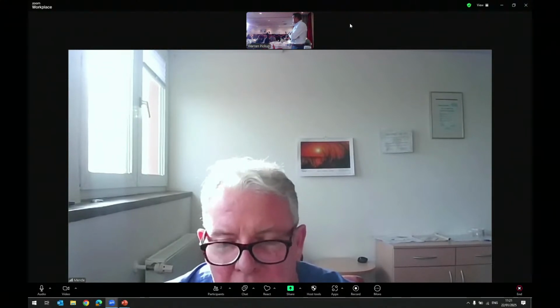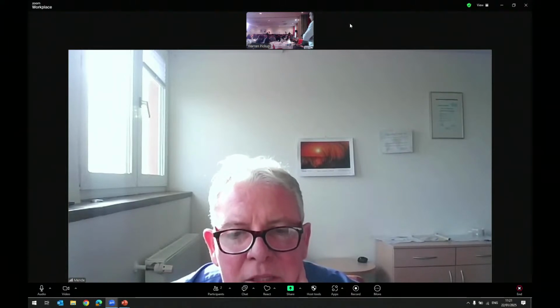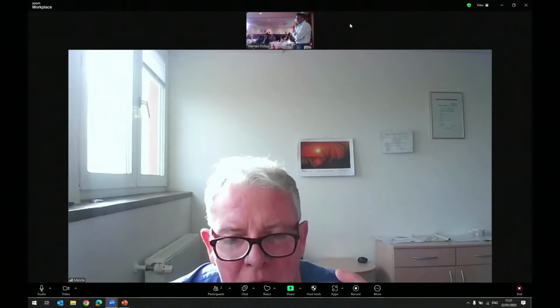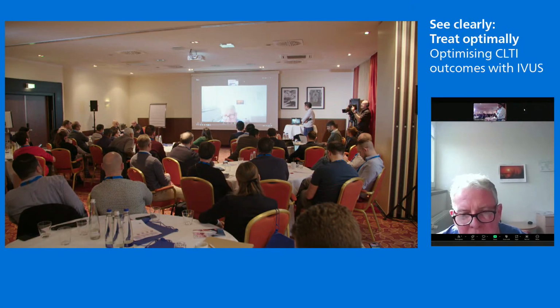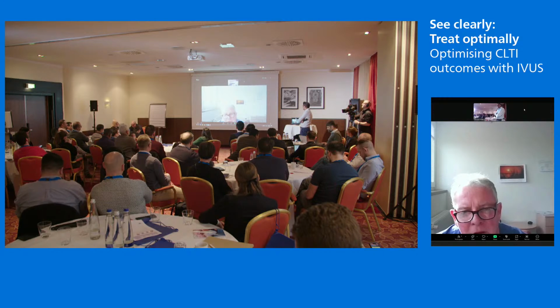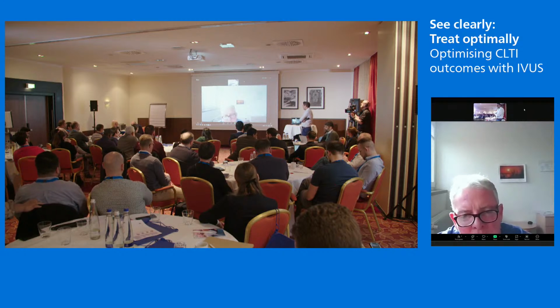Definitely it's much better then, because as I said, the laser wouldn't do debulking; it would just change the structure of the organic tissue, which is still embedded in the calcium. So that probably evaporates, and then if you dilate the calcium, it's much softer, but it's not gone. So that's definitely a case for calcium. It's definitely for Phoenix.